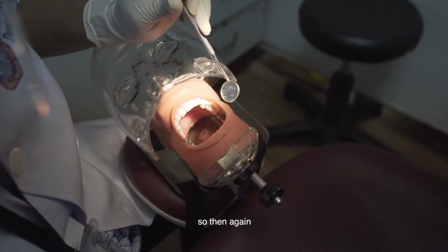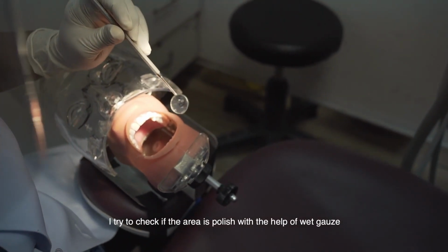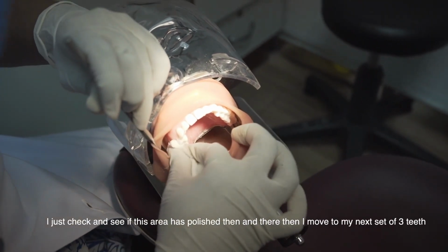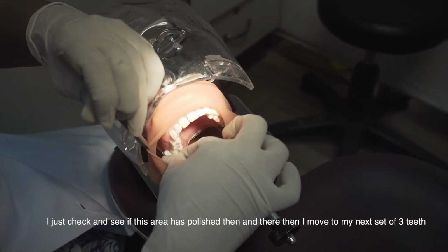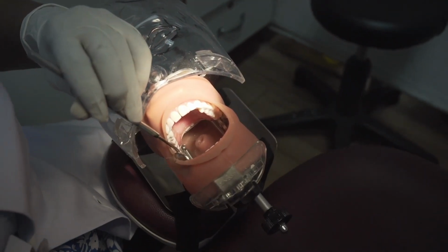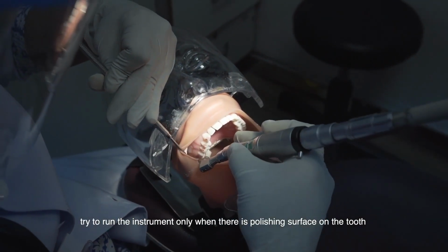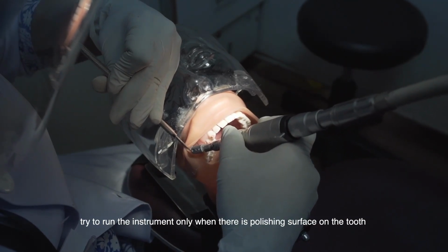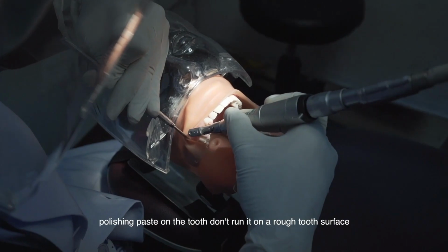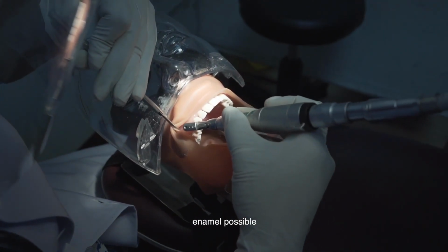Then again I try to check if the area is polished with the help of a wet gauze. I just check and see if this area is polished then and there. Then I move to my next set of 3 teeth. Don't run the instrument unless there is polishing paste on the tooth. Don't run it on a rough tooth surface. You will end up removing most of the tooth enamel.